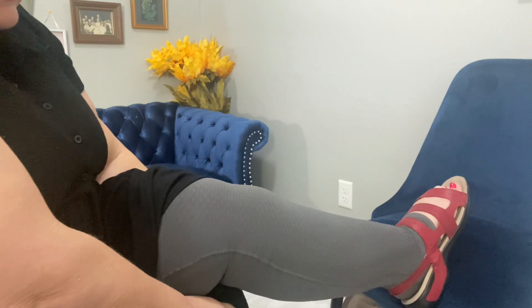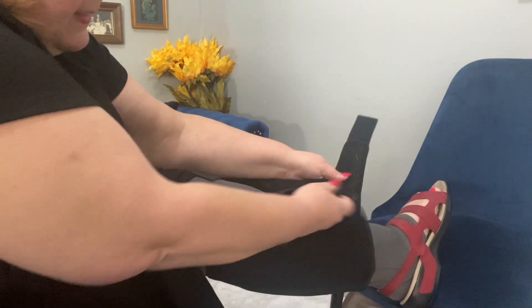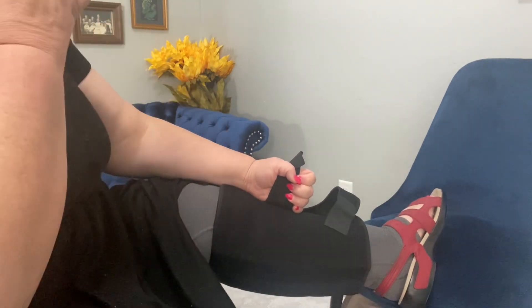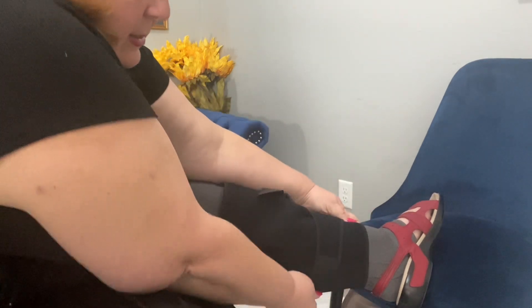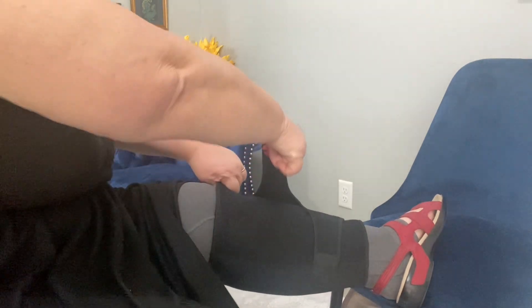I'm going to show you how I would put this on in the morning — I'm actually going to wear it for a couple hours today. You just sort of wrap it around your leg, and for me my biggest area of swelling is the medial part of my calf, so that's the part I really want to give the most support to. It's got quite a bit of stretch to it with a neoprene backing.